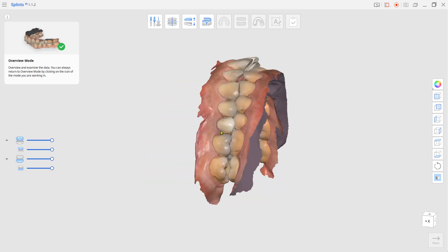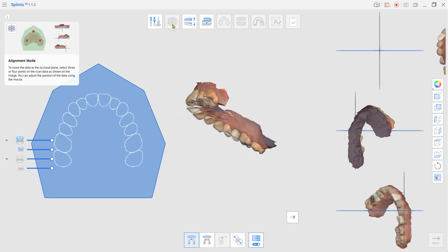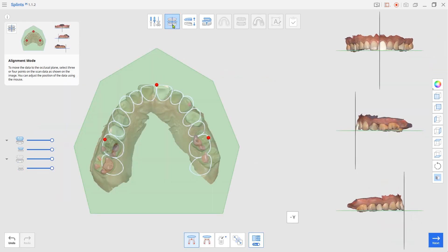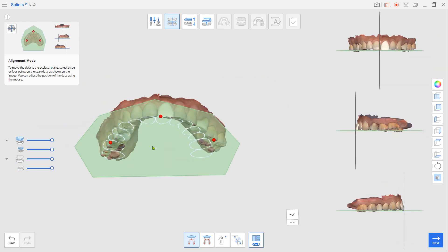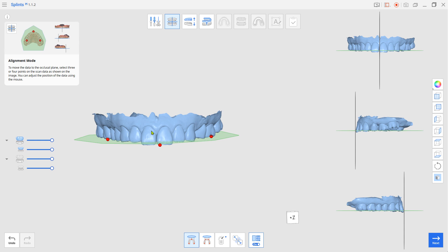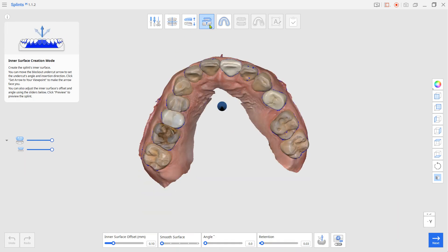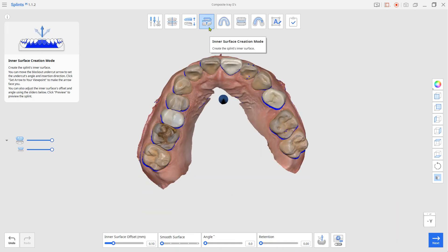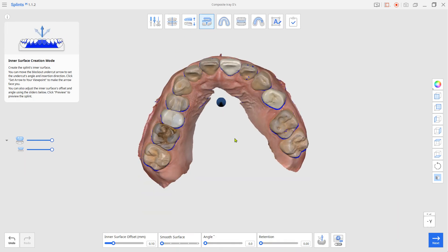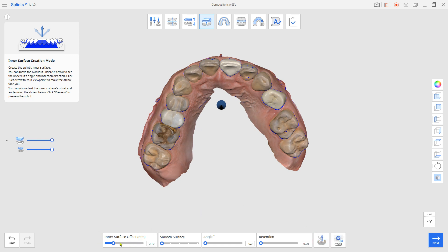Set up the teeth along the process. In Inner Surface Creation mode, set the insertion path and the inner surface offset for the internal space, and select Maximum on the retention.